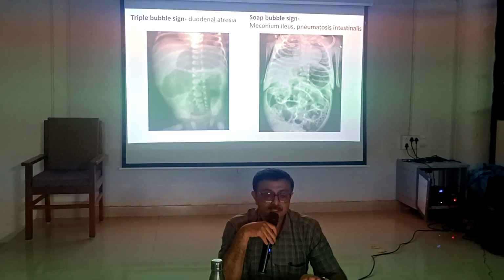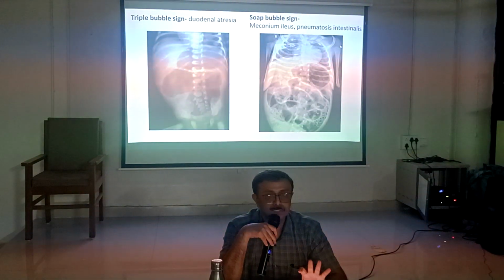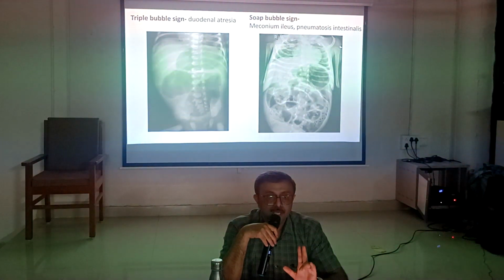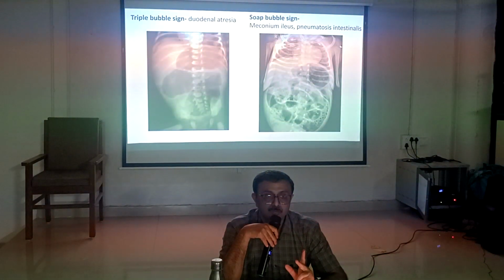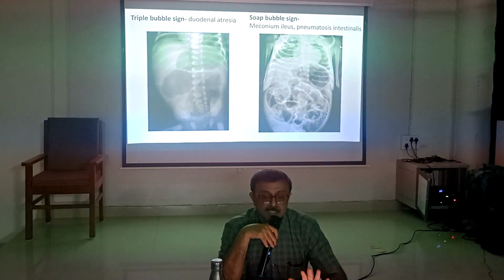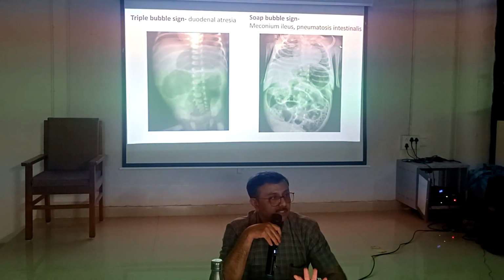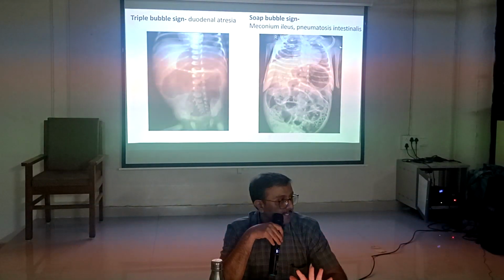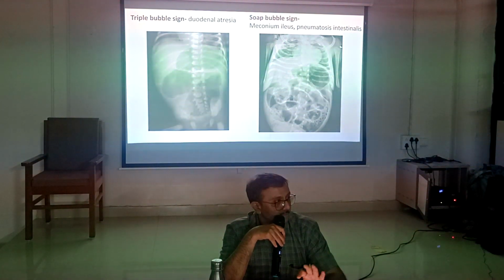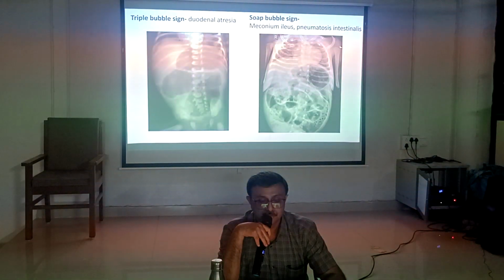Soap bubble sign: it is meconium ileus. Pneumatosis intestinalis means gas in the wall of bowel. Again, pneumatosis intestinalis suggests what? Necrotizing enterocolitis or megacolon. Toxic megacolon. Yes, toxic megacolon.